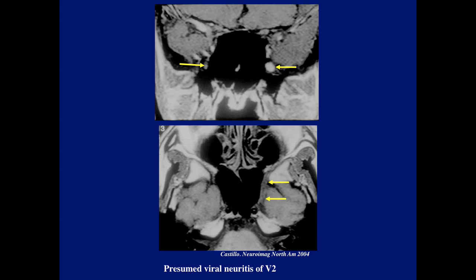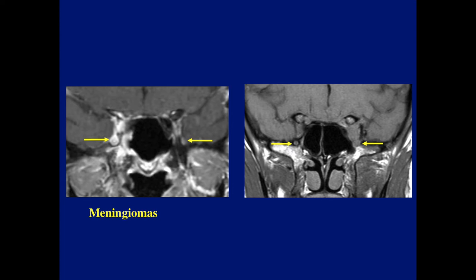Here we have a case of presumed viral neuritis of V2, causing expansion of the foramen rotundum — we can also see abnormal signal in the cavernous sinus and in the region of the foramen rotundum. Here are two separate cases of meningioma: in the first, we see meningioma in the cavernous sinus which also invaded and enlarged the foramen rotundum. In the second, meningioma within the cavernous sinus extends to the orbital apex and enlarges the foramen rotundum, compared to the normal side.